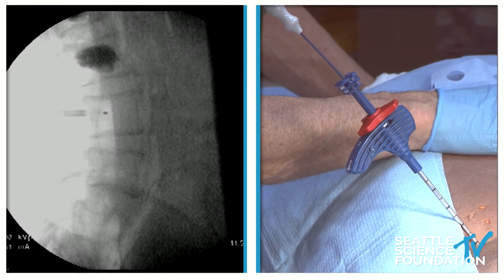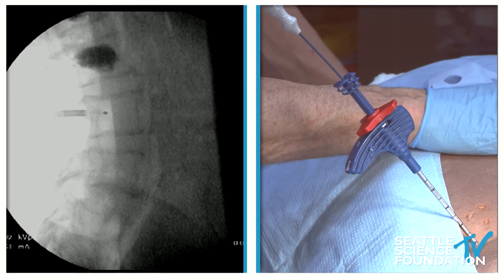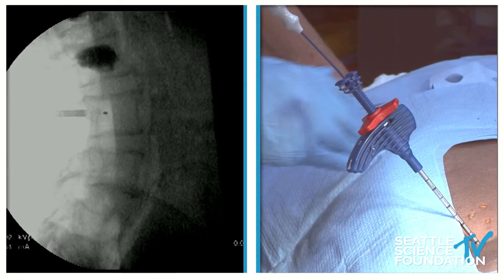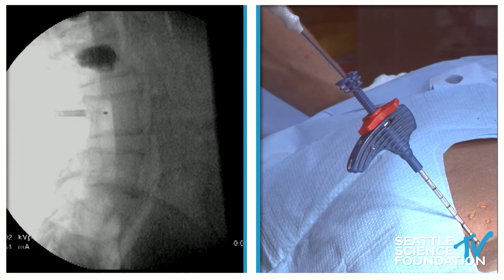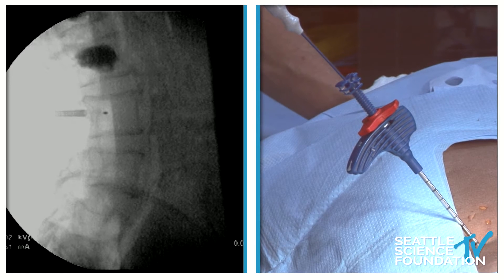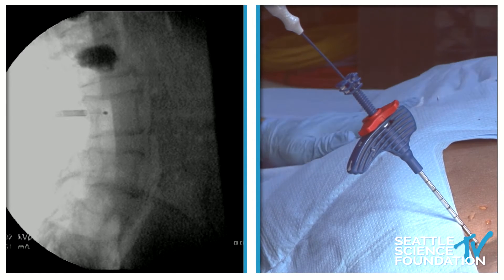How far back can you go and still be safe? You can go as far back as one centimeter anterior to the posterior wall. Anything closer than that puts the cauda equina at risk.